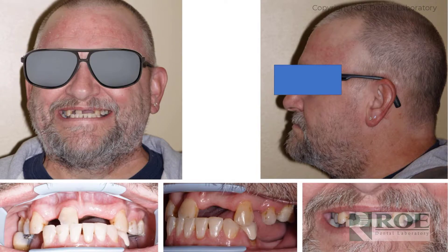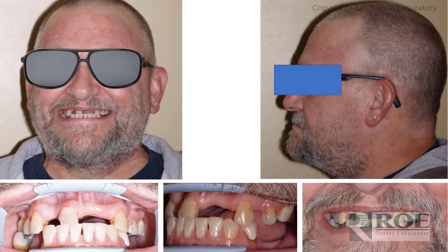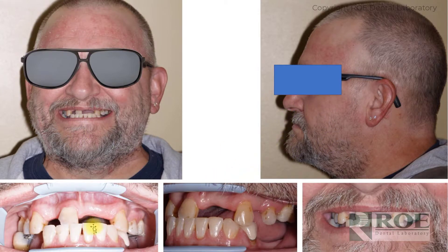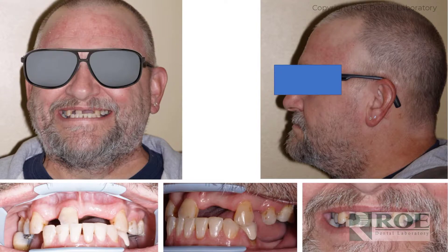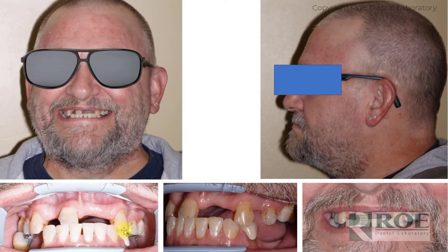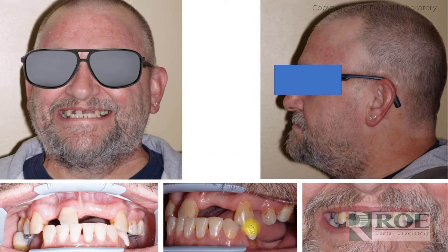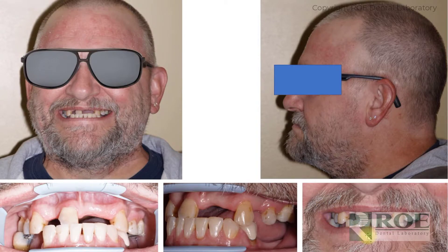Because this patient is dentate, we want to see a full-face picture, full-smile picture, profile picture, and then retracted in occlusion so that we can see how the teeth come together and verify it on the model. So: full face, profile, left, right, center, retracted — even this picture here should be retracted.